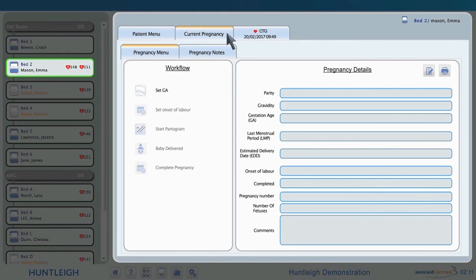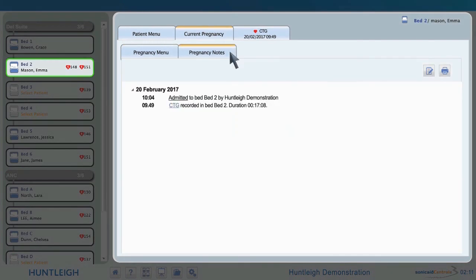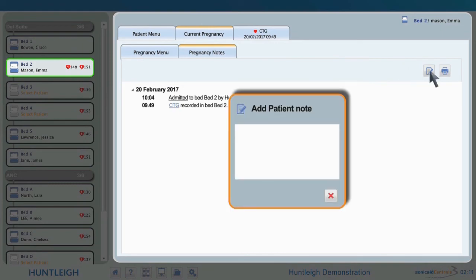After delivery, the birth details can be entered and the pregnancy record closed to complete the workflow. The pregnancy notes will show the list of CTG traces, annotations, and analysis sessions. Also, general notes can be added to the list.